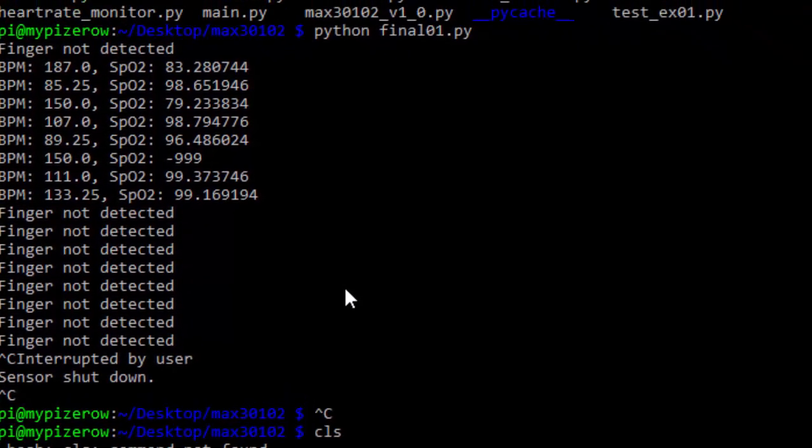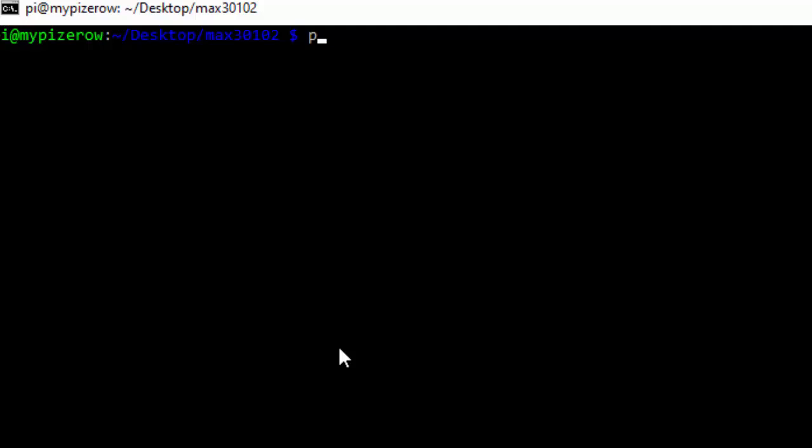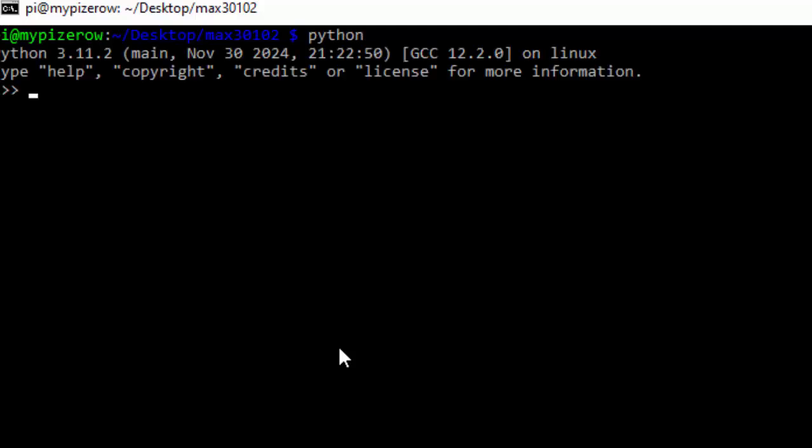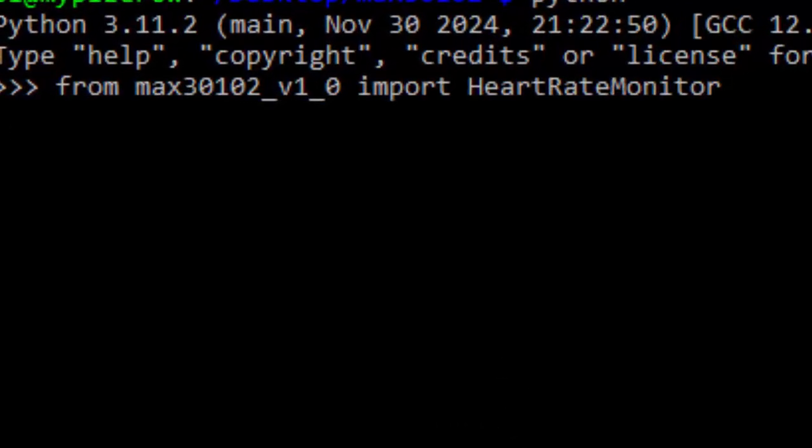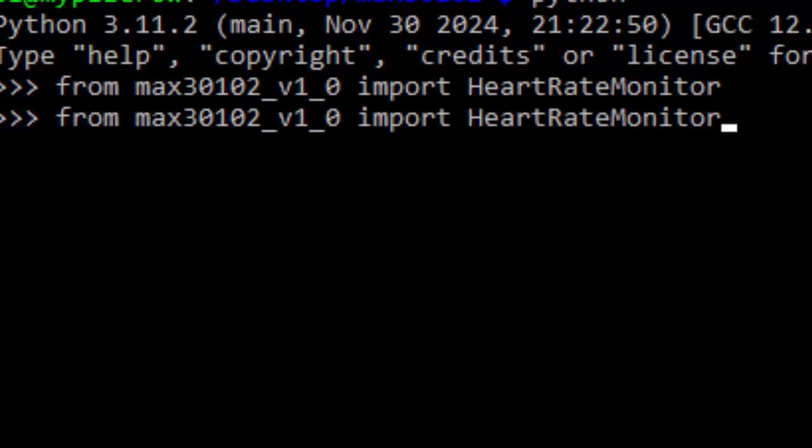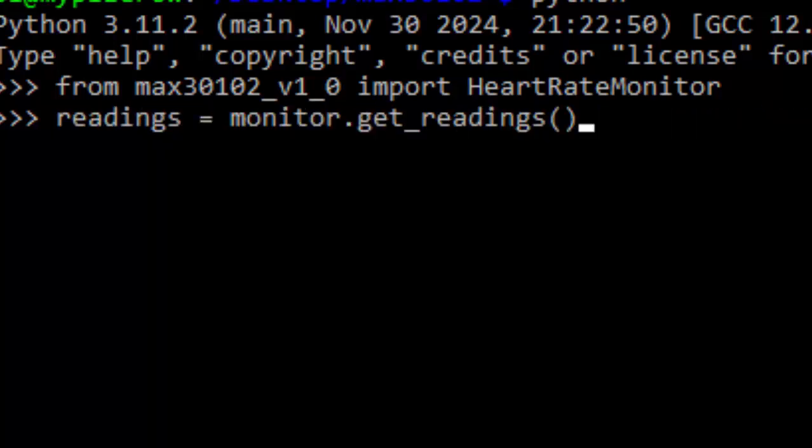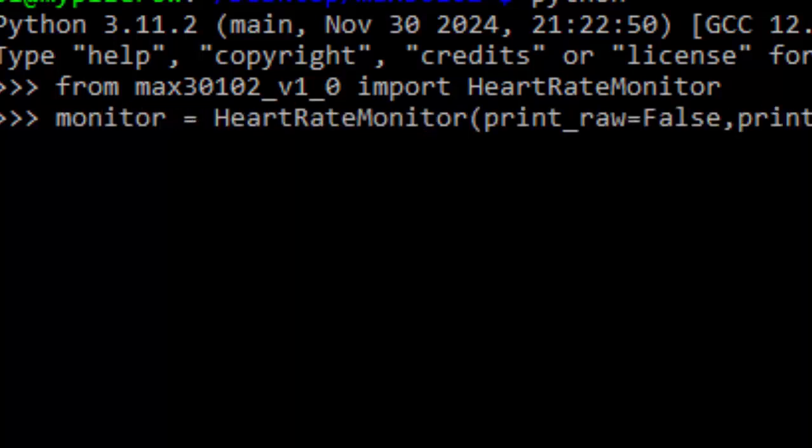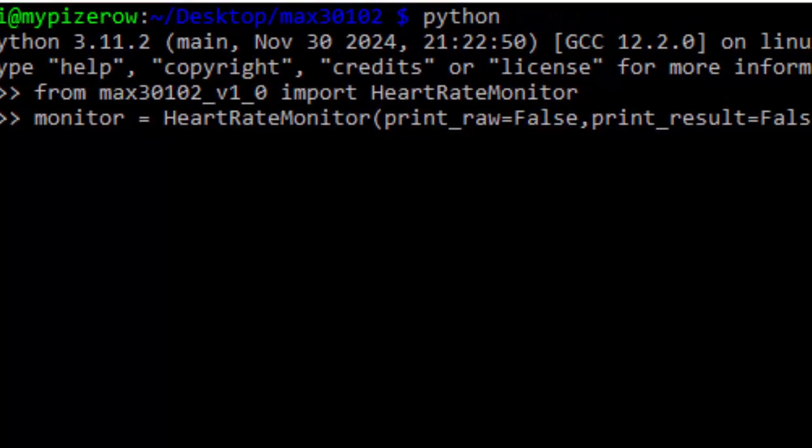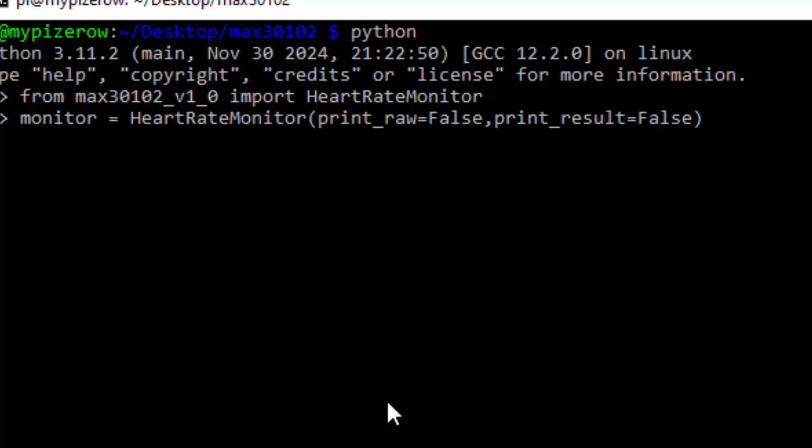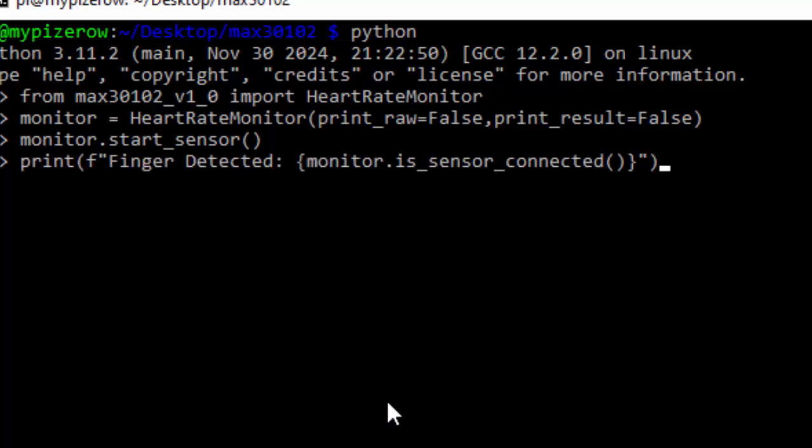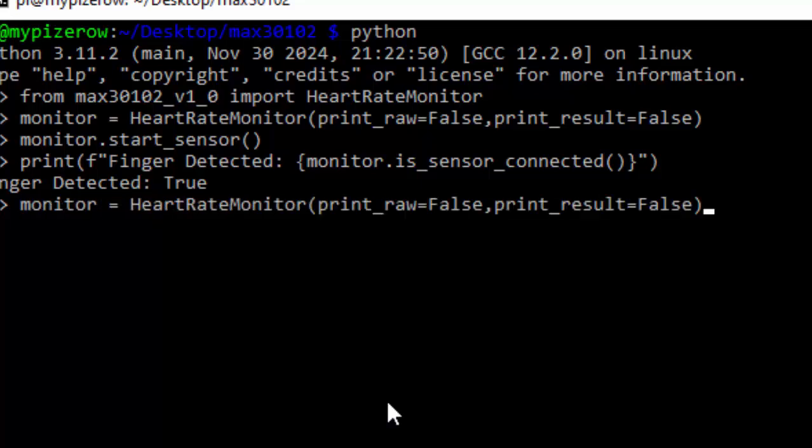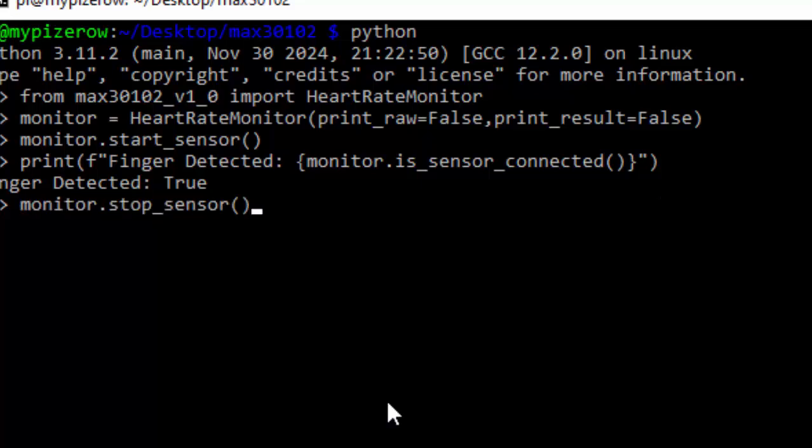I will close the sensor by pressing Control-C, then I will come and open Python. Inside Python I will just import the same class from the file which I created like this: from max30102_vi_0 import HeartRateMonitor. Then I will create an instance of this class. Monitor equals HeartRateMonitor, and the print raw is false and print result is false, so it will not continuously print the result. Then I will just simply monitor.start_sensor, just like before. Now it will continuously monitor the sensor value. If I place my finger, nothing will happen because I mentioned that print result is false.